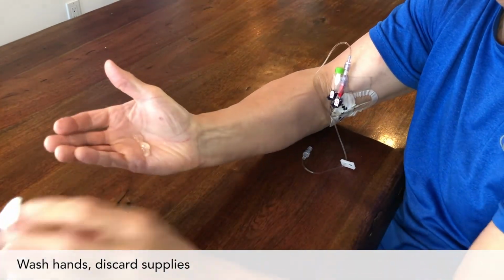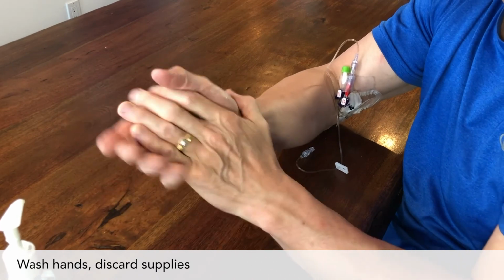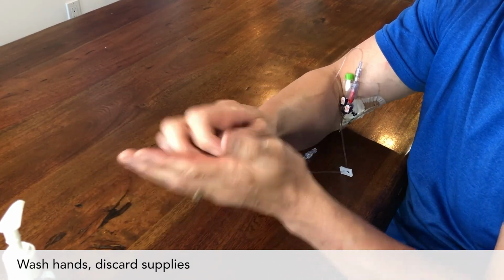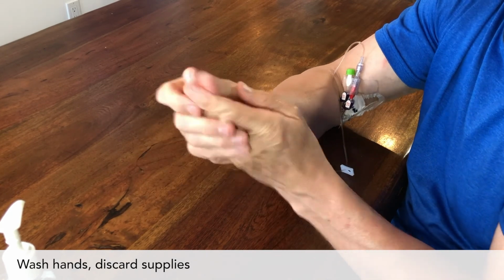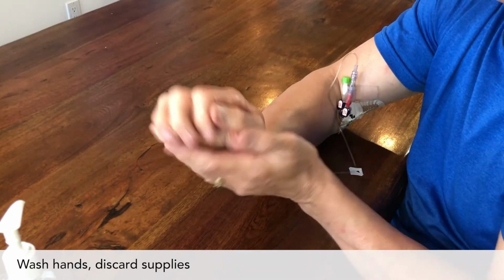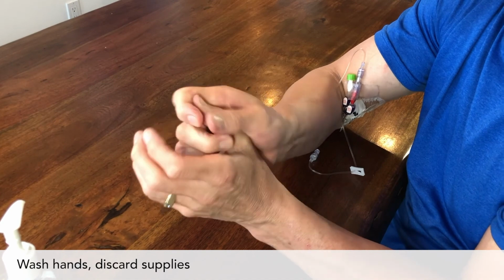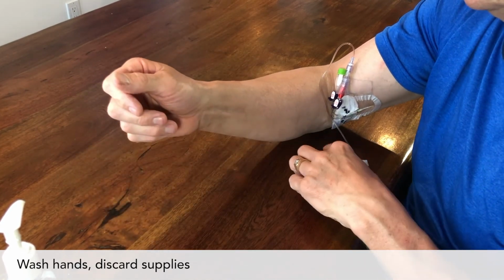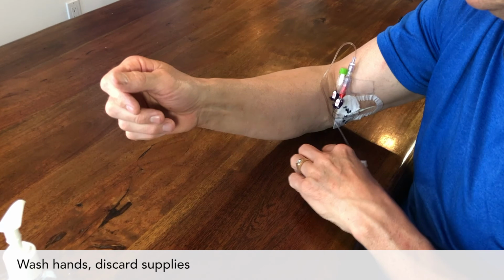And you're done. That's it. You need to throw out the supplies, including the pump, as your healthcare provider showed you, and you need to wash your hands. When it's time for your next medicine pump, you'll do this all over again. Don't forget to take your next Easypump out of the fridge so it can warm up in time for your next dose. Using your Easypump will get easier each time that you do it.